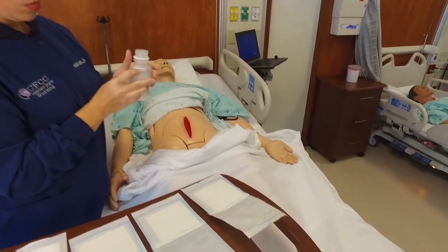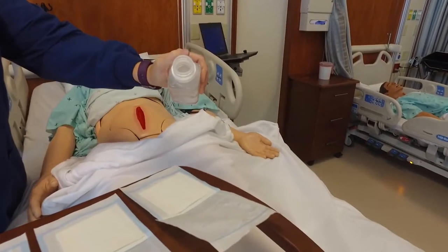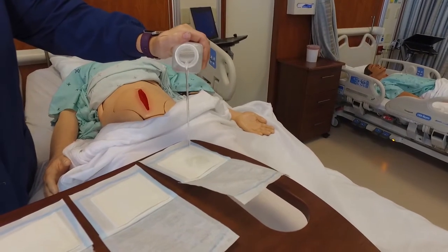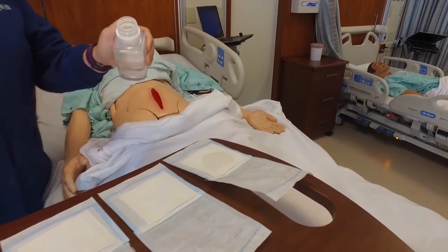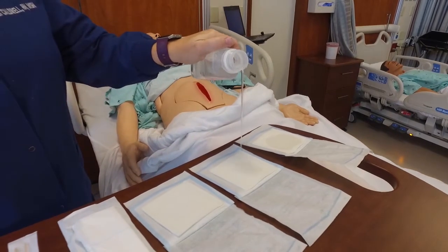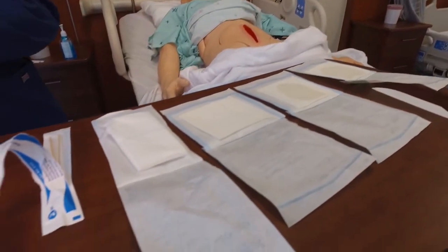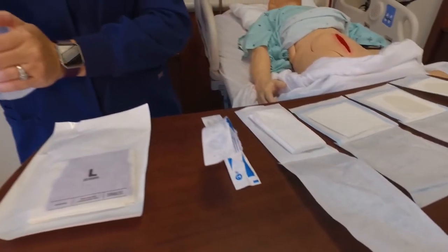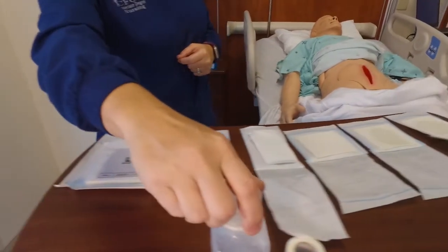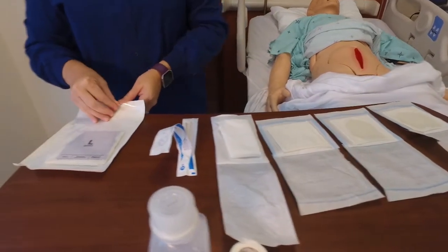The nurse will pour a small amount of normal saline on 2 of the open 4x4 gauze packets, keeping the bottle at least 6 inches above the table and being careful not to create splashes or reach over other open packets. Next, the nurse will don sterile gloves.